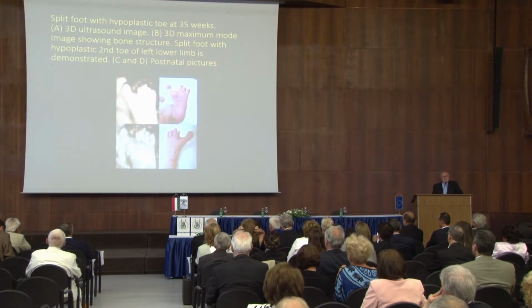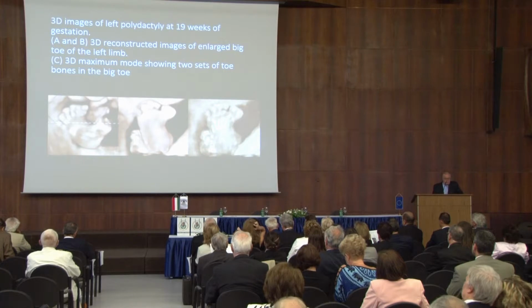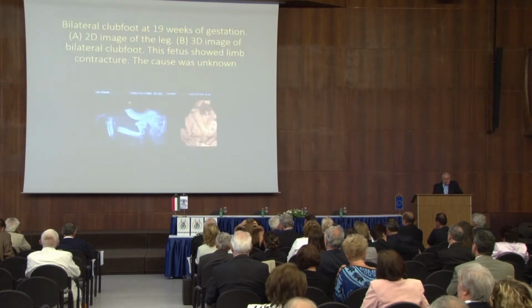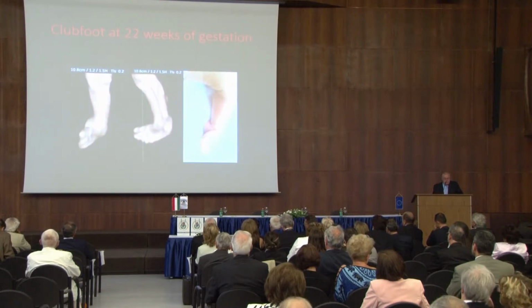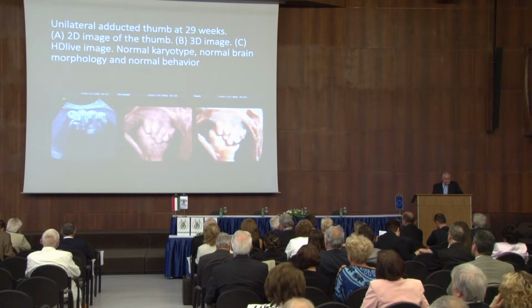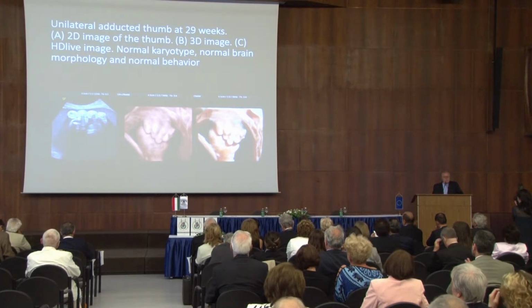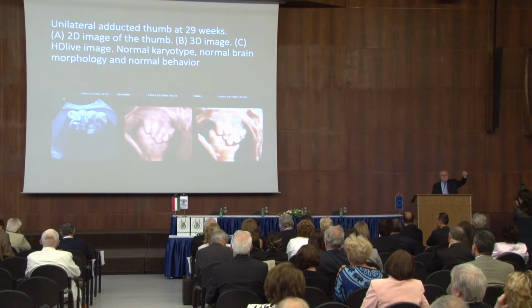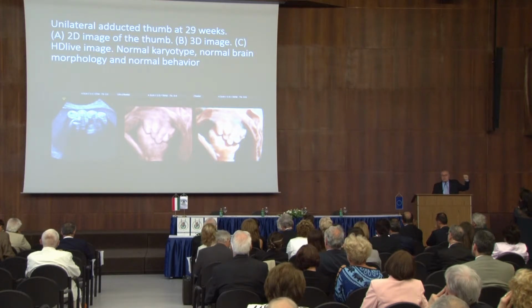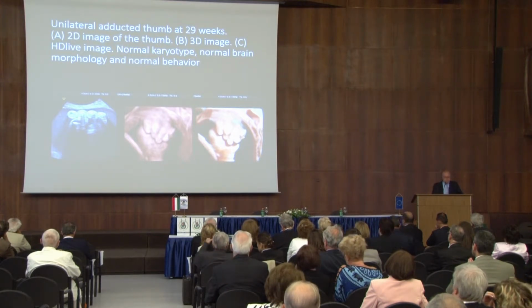Some limb deformities. Limbs do contain very important diagnostic information for many trisomies, and it's a routine part of serious examination by 3D sonography. Just a few pictures of abnormalities, and a good examiner should really look for that. Clubfoot at 22 weeks of gestation is a very frequent consequence of maternal infection. Again, you have here an adducted thumb. In our research on cerebral palsy, lasting 10 years, the adducted thumb, we call it the neurological thumb, covered by the fingers and not visualized, was in large 10-center studies the most important sign of cerebral palsy. And we now have 11 cases of cerebral palsy detected antenatally, the best cases in a long history of modern obstetrics.